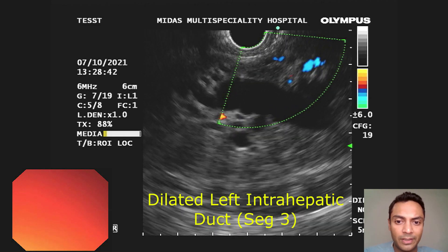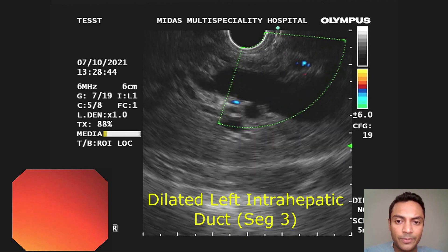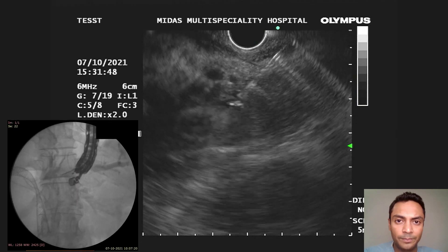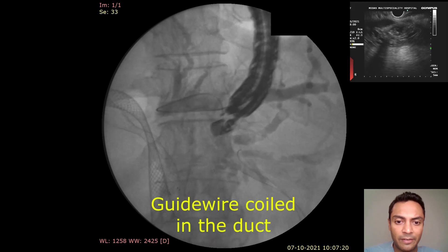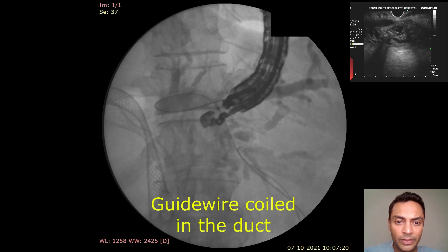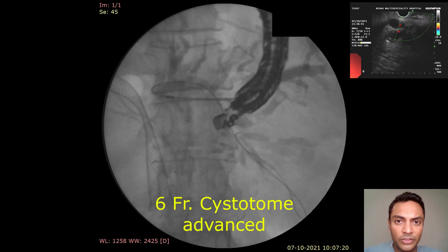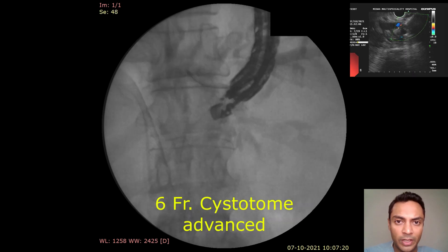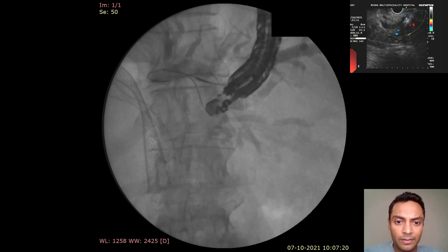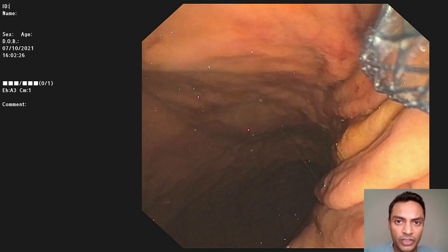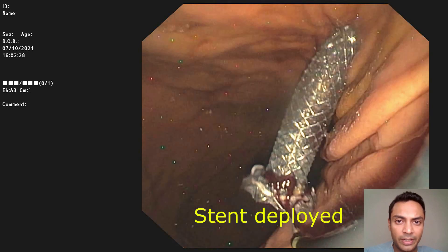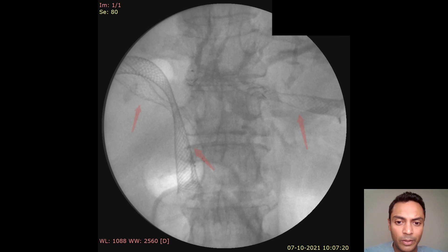For the left intrahepatic duct, under EUS guidance, this was identified across the gastric wall. A 19-gauge FNA needle was advanced and contrast injected to confirm presence in the left intrahepatic duct. A guide wire was coiled successfully towards the hilum. A 6-French cystotome was advanced to create a fistula tract, followed by placement of a geobar stent, which is a partially covered hepatico-gastrostomy stent with about three centimeters deployed in the gastric lumen.